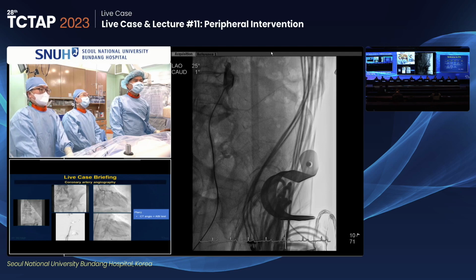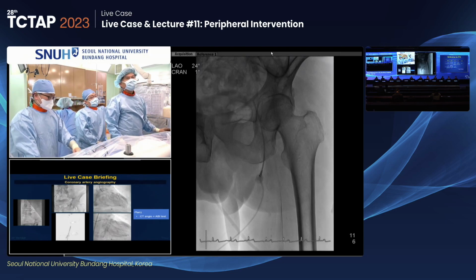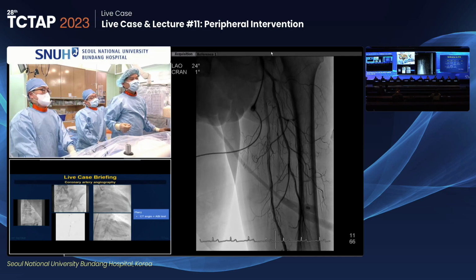Shall I continue? Please tell us what you've done, Dr. Raj. You're leaving us in suspense here. Yeah, this is our live. So I will show you what I have done.